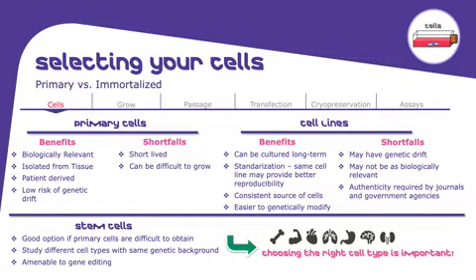You can work with primary cells. They are usually isolated from patient tissue or a healthy individual and are far more biologically relevant. However, they do have limitations. It's more difficult to grow primary cell lines, and they also have a short lifespan of about 5 to 6 passages.